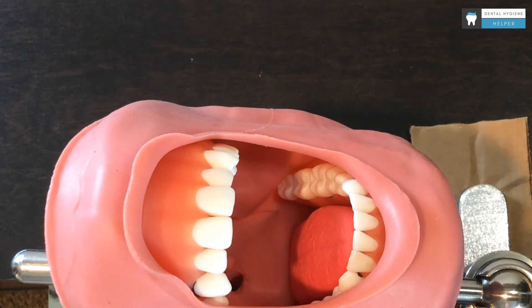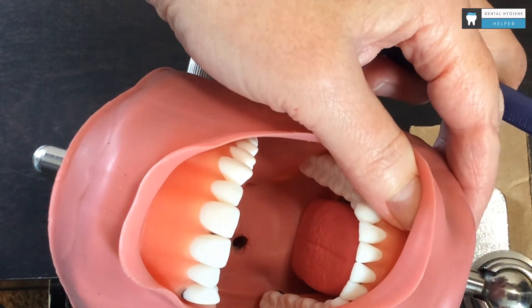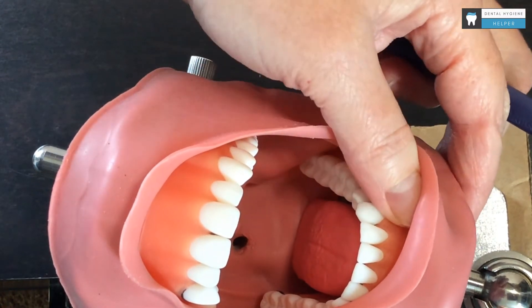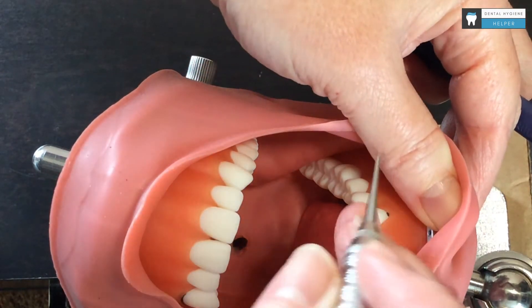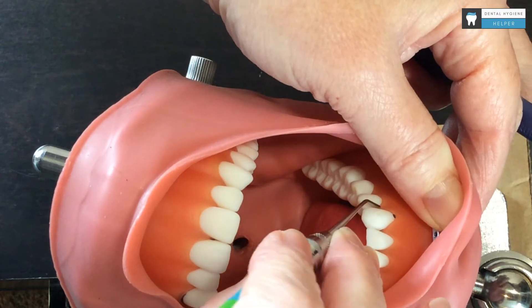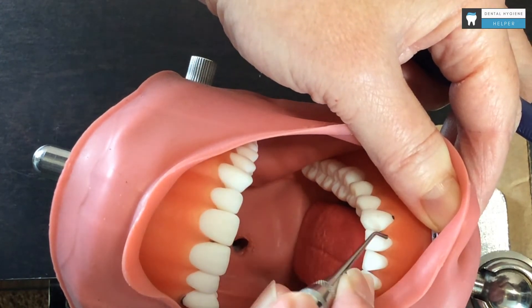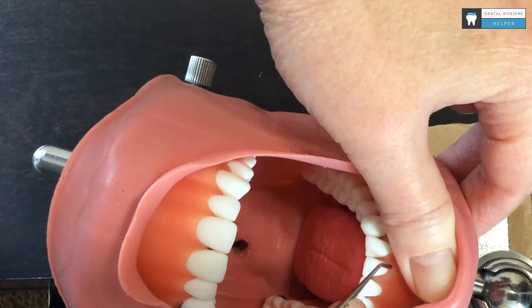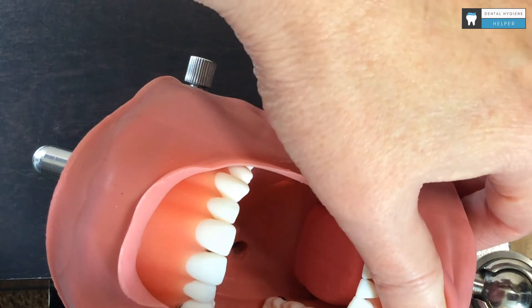For the surfaces away from me on the lower fronts, you can have the patient turn towards you a little bit if you want, but I am going to come behind them from 11 to 1 and retract their lip. I am up on the incisal a little bit towards the buccal as I do the facial surfaces away from me, moving my retraction finger as I come back.